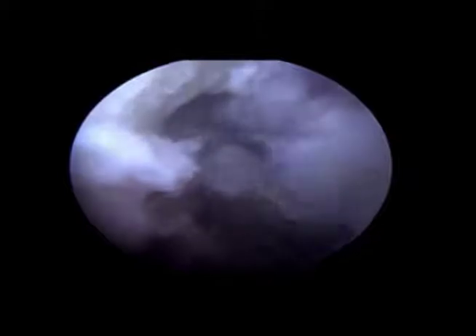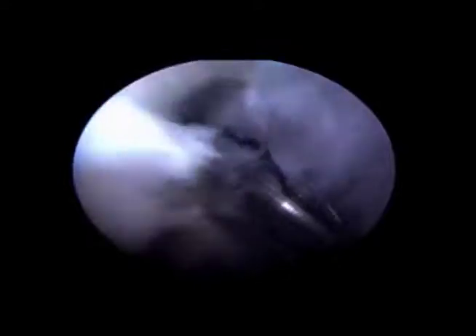A shaver and a blade are used to expose the acetabular rim in preparation for rim decortication using a 5.5 mm motorized burr. The acetabular rim lesion is readily identified after rim removal to the predetermined depth as determined on CT evaluation. In this case, 4 to 5 mm of resection exposes the lesion, and the surgeon must remain vigilant to avoid inadvertent cartilage destruction.